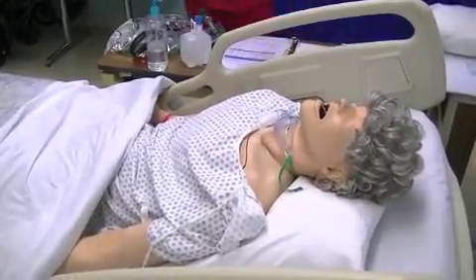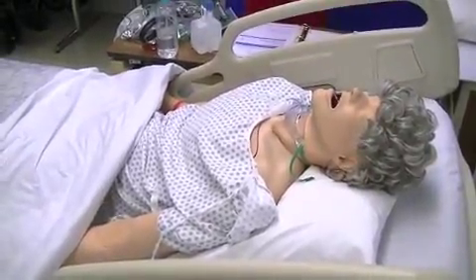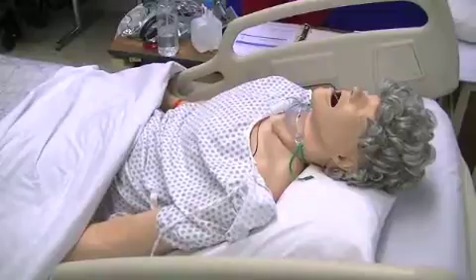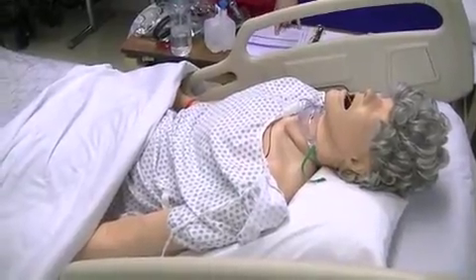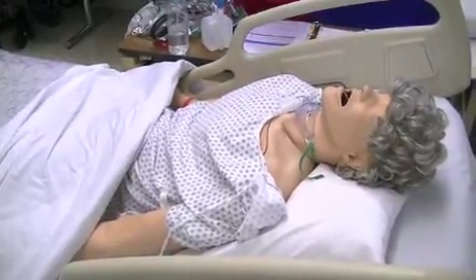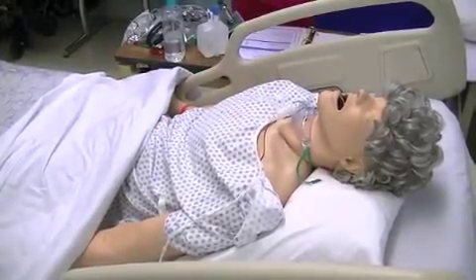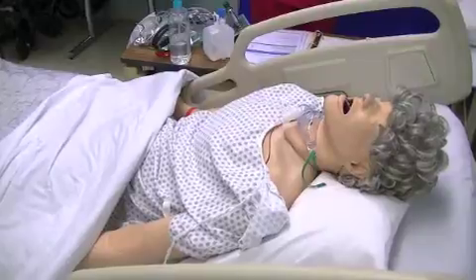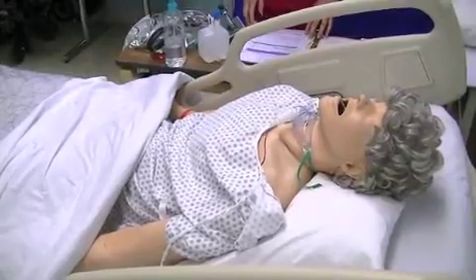Again, we're going to assess respiratory status, because putting on oxygen is an action, an intervention. We're going to check the respiratory rate, rhythm, and depth. We're going to listen to breath sounds and document clear auscultation, or if they have adventitious sounds like wheezes, crackles, or anything like that. We're also going to look at capillary refill, and nail bed clubbing of the nails, which should be less than 180 degrees. And we'll look at pulse oximetry results, which was about 90. All these things determine if they have a need for oxygen.